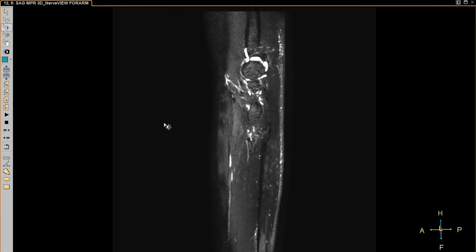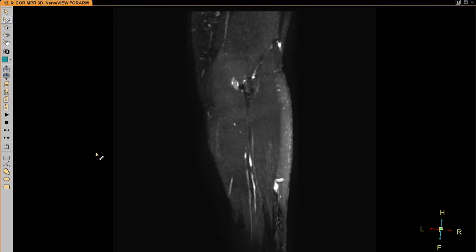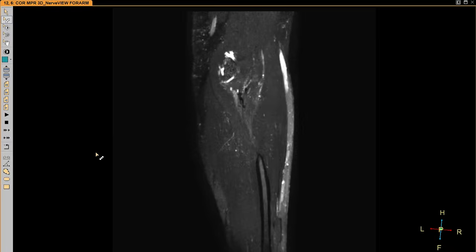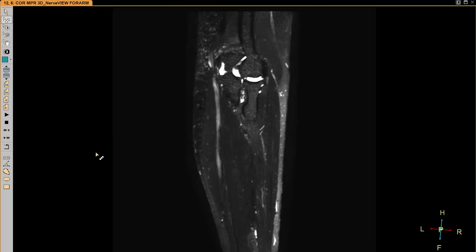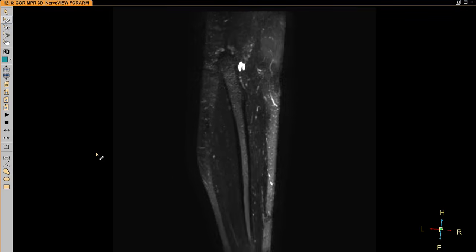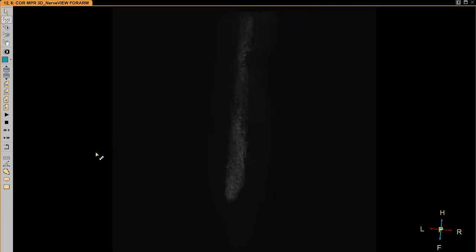Often the radiologist may be looking for any thickening of the nerve or other sorts of little signs that there's going to be some irritation there, and often they can show a little bit of fluid in the joint or a reason that the nerve might be irritated. But directly seeing that the nerve is inflamed is something that is very new, and something that has become a very diagnostic confidence builder for both the referrer and the radiologist.